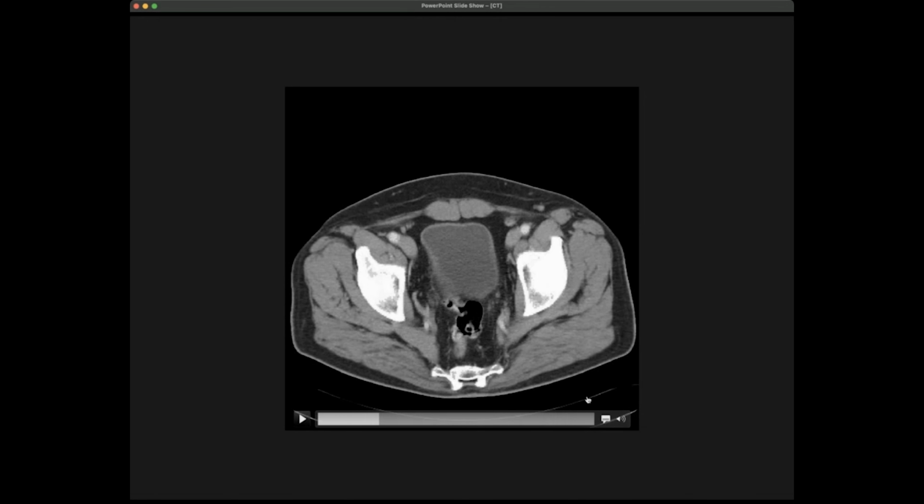And here you see already this kind of white line below. As I told you before, this is actually the table that the patient is on, because obviously the X-rays have to go through the table, although you make the table out of material which is not attenuating a lot. So in the past it was wooden tables. Now it can be tables of some kind of plastic.